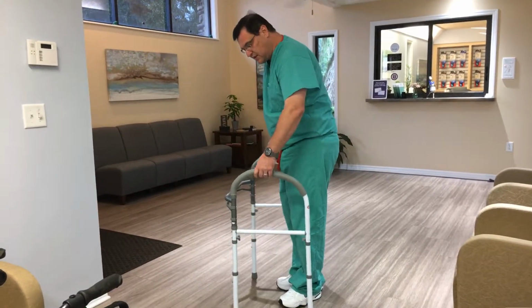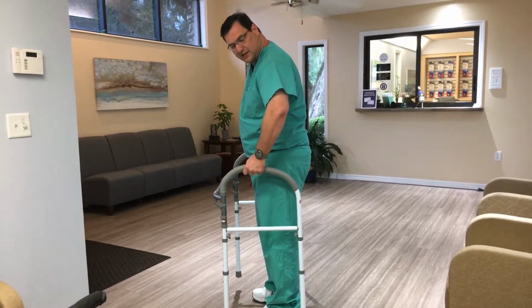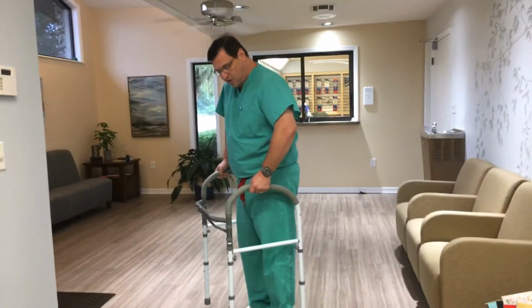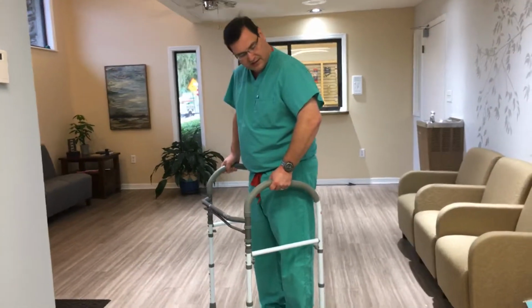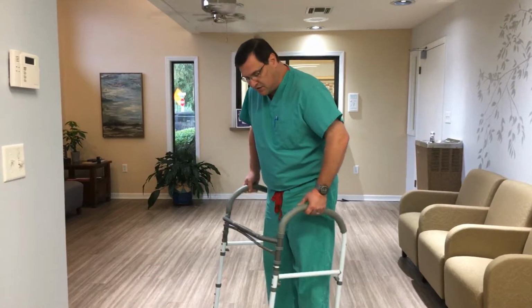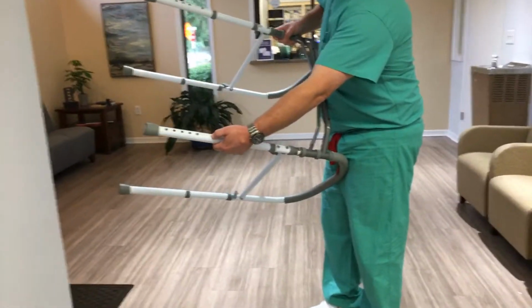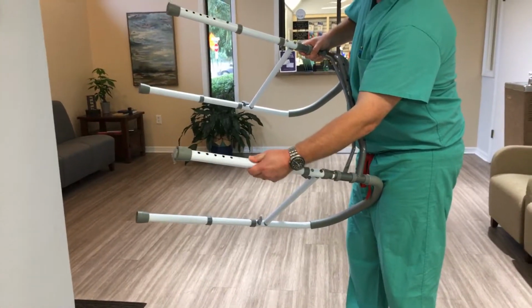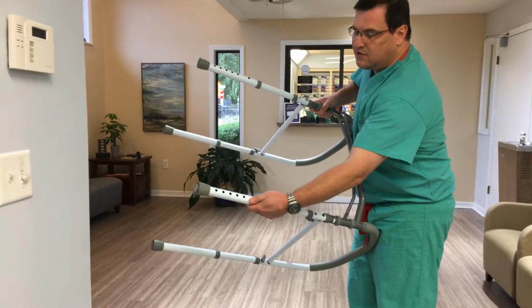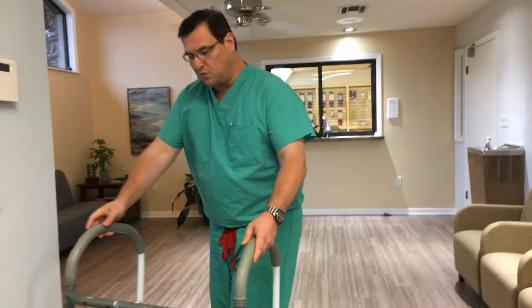Now, in adjusting the walker, what you want to do is usually have it up at a 15-degree bend with your elbows. That way you can put the weight on the walker. The proper height is for a 15-degree bend at the elbows. This one is already adjusted to its max height. But what you do is just basically push the thing and adjust down, okay? And that's how you adjust the walker to the height, okay?